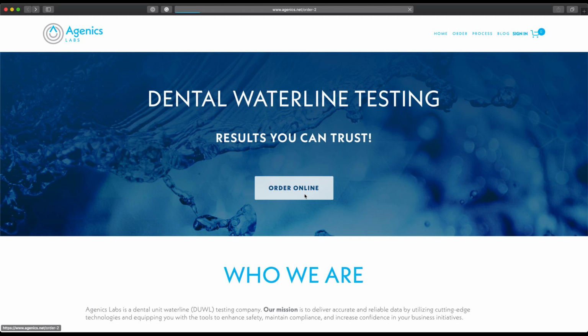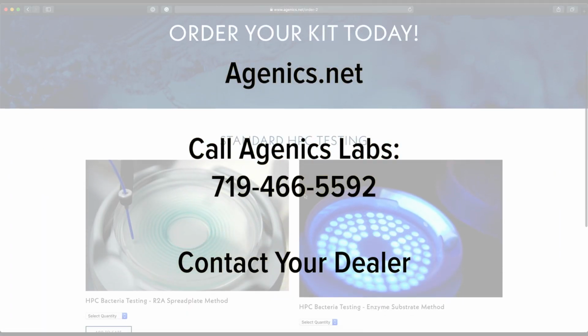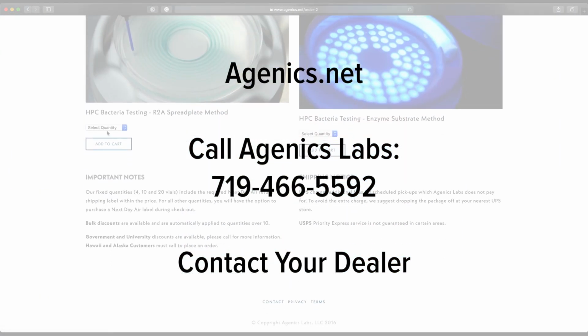Okay, if I'm a dentist, I know I need to be compliant. And of course, I want what's best for my patients. How would I start the process of ensuring the safety of my patients and my practice? The dentist can go online to our website, call us, or contact their local dealer to place an order.